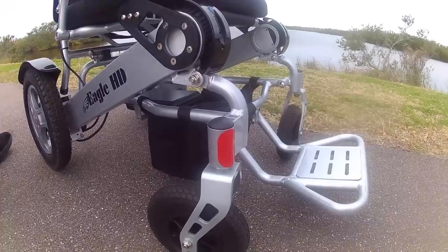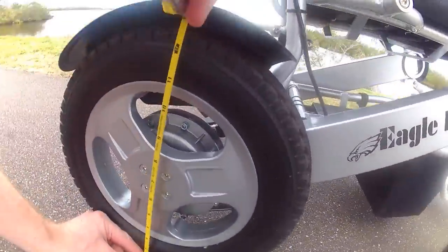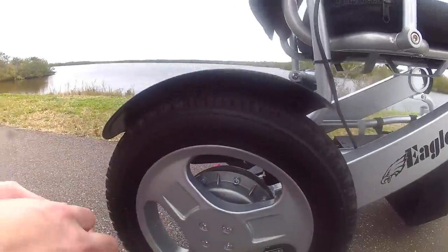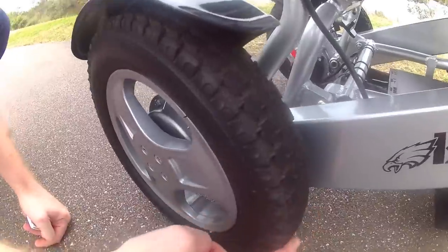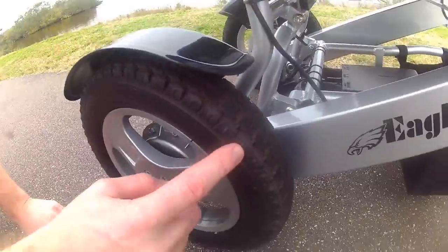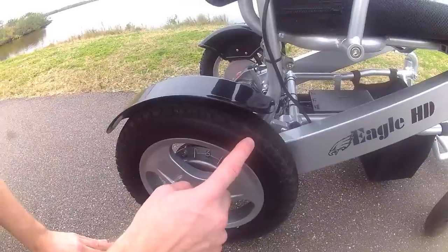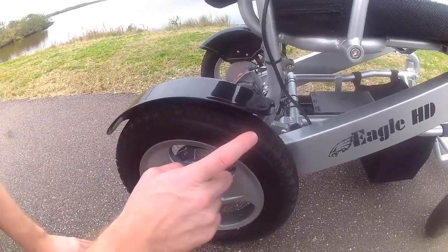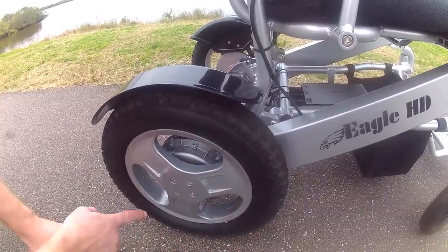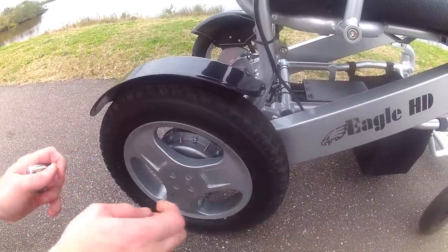The rear wheels are a good 12 inches and, as you can see, are ridged and grooved, able to take on a lot of different terrain. They use heavy-duty, high-quality black polyurethane. Unlike folding power chairs with gray wheels that easily wear out, these wheels last a long time and have the ability to tackle a lot of tough terrains, as we'll show you.